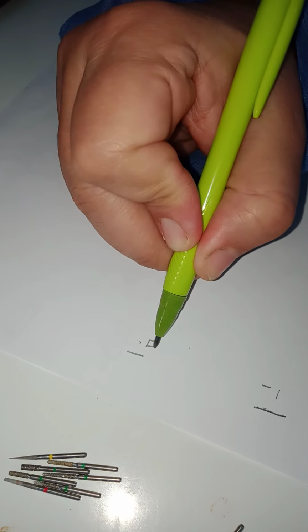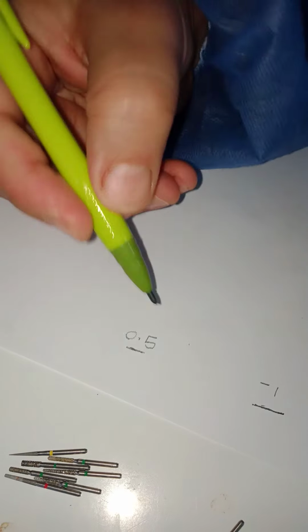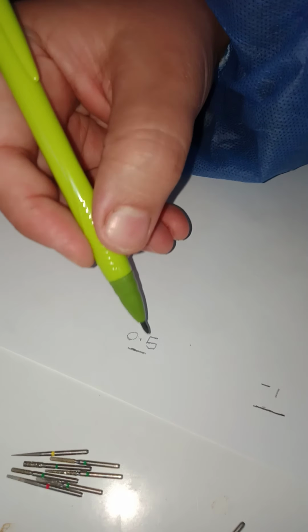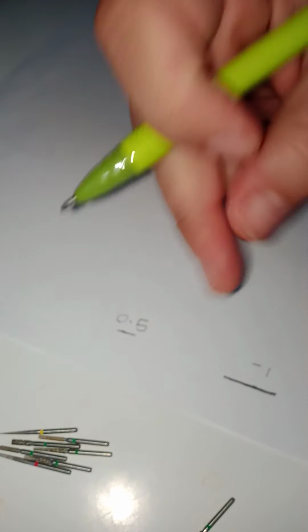If the technician wants to see this edge and feel it as a step on the tooth, to know where to place his crown, he needs a step. So the minimal step you can create that can be visually detected by the technician on the cast is 0.5 millimeter. I'll call it a shoulder when it's 1 millimeter or more, depending on the material, and the maximum is 1.5.